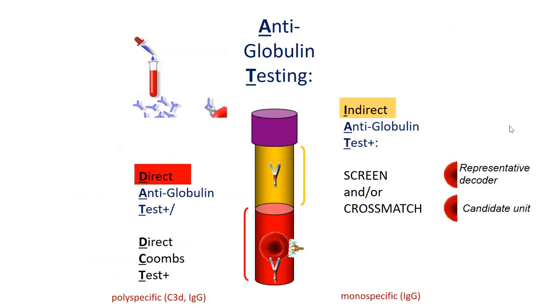Now, the Coombs reagent, or anti-human globulin testing, can encounter a blood bank specimen in one of two ways. In direct testing, if we are pipetting up erythrocytes to examine for existing immune deposits or opsonins, IgGs already bound to a host's red cell population or complement, already opsonizing those red cells. There are polyspecific Coombs reagents that can be sensitive to the deposit of either.